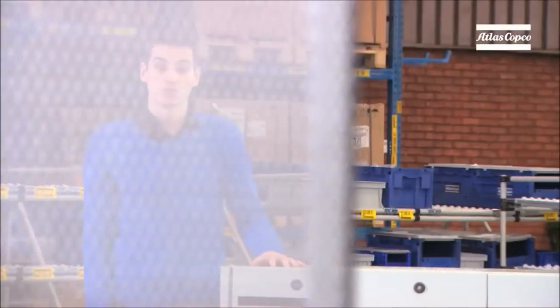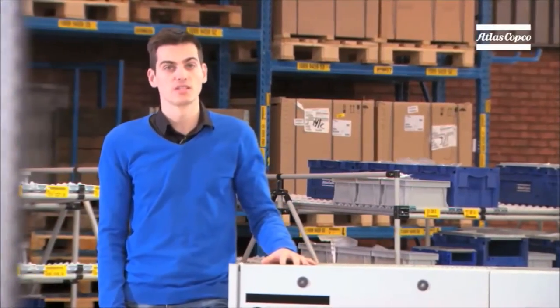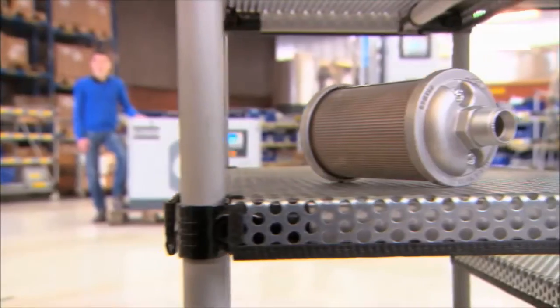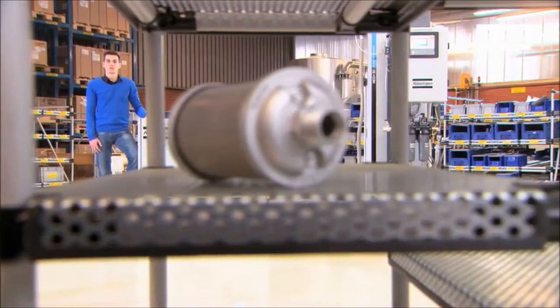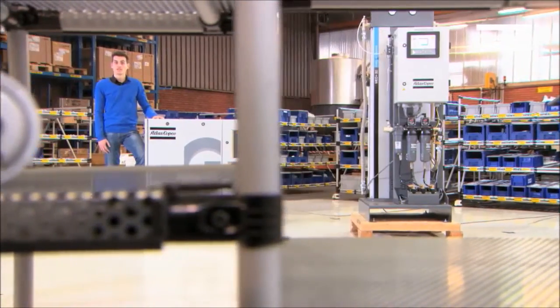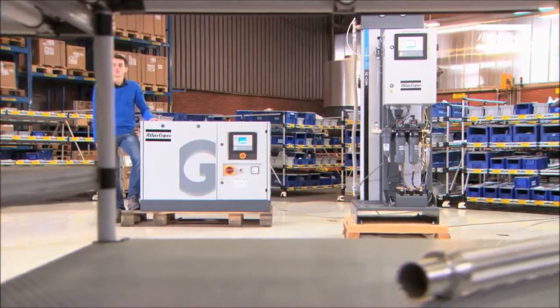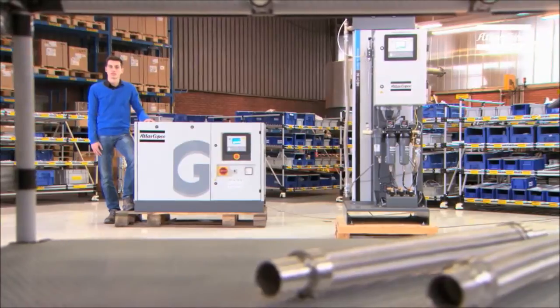These compressors can either be fixed speed or VSD compressors. The variable speed drive is an option that is certainly worth considering. The VSD compressors tune their output flow exactly to the air demand of the hospital. This saves on energy and is therefore the sustainable solution for hospitals that are concerned with the health of the environment, not only that of their patients.